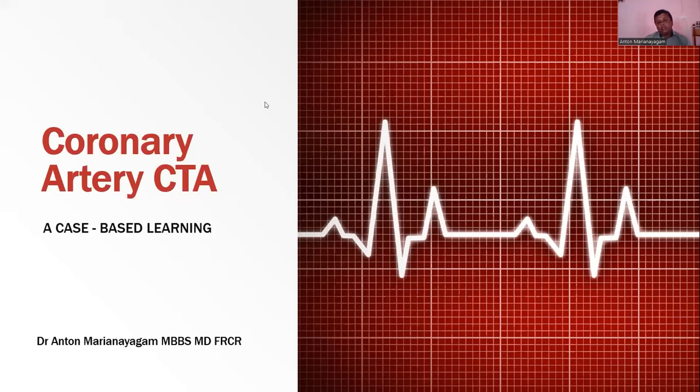With intermediate risk category. But now there are reviews of many studies done in thousands of patients, which are giving us promising results about CT coronary angiogram in using in emergency setting as well. So the purpose of this lecture is, I'm not going to dive into deep technical details. What I'm going to do is give you a brief introduction of what we are doing when we do calcium scoring or CT coronary angiogram. And I'm going to show you a few cases to demonstrate their utility in the clinical setting.